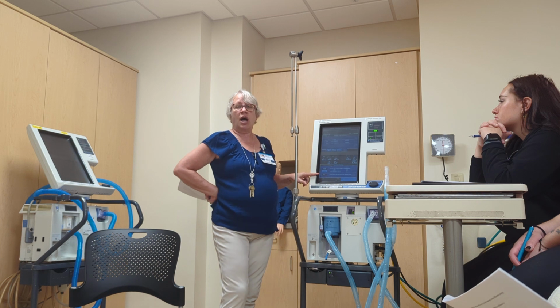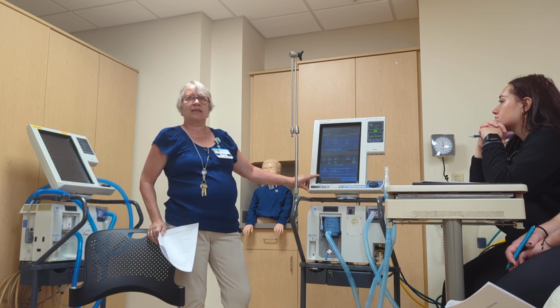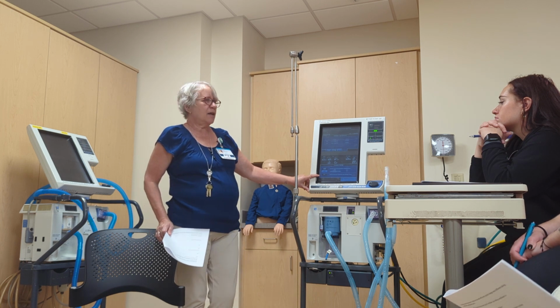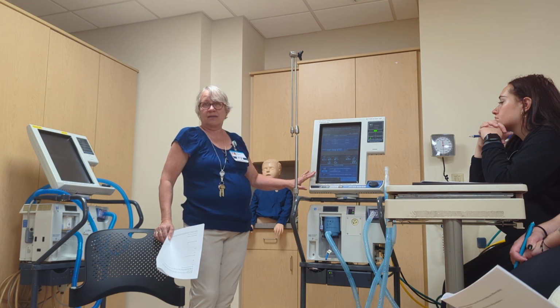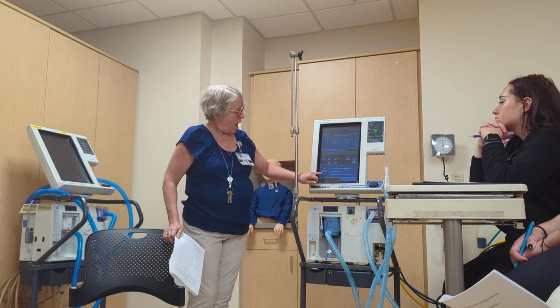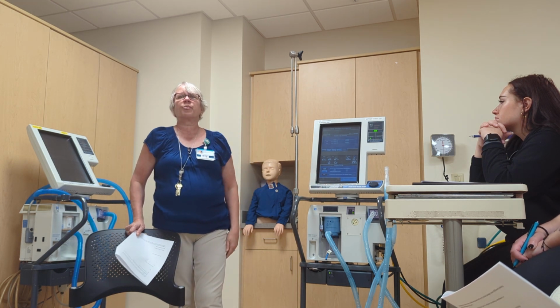What I want you to understand, and like I said, we're not going to run them in this lab because I don't have enough pressure. I've never had enough pressure in a lab to make them pass. They'll fail, and then I have to send them down to BMET, okay? I will hit SST, and I will follow the prompts.